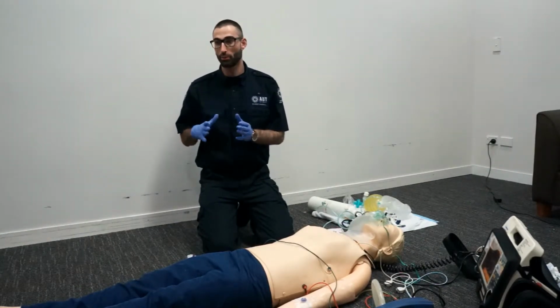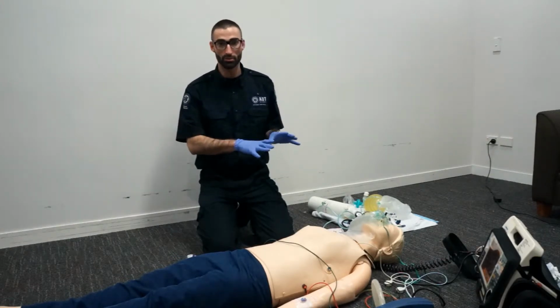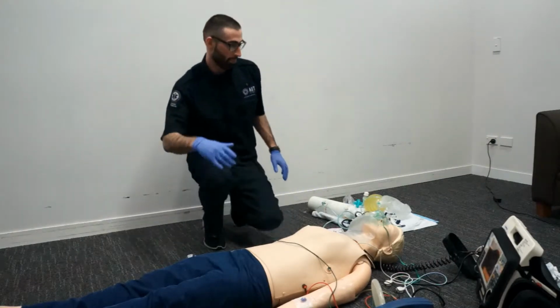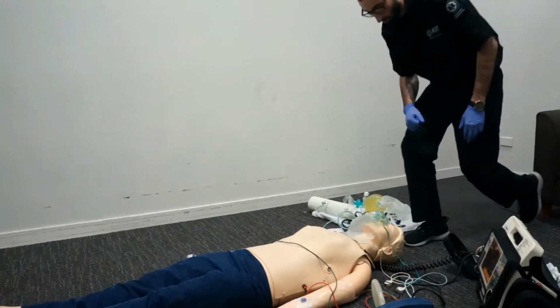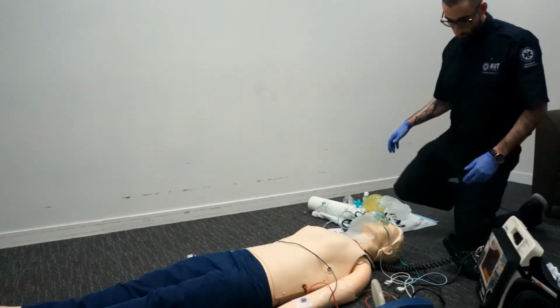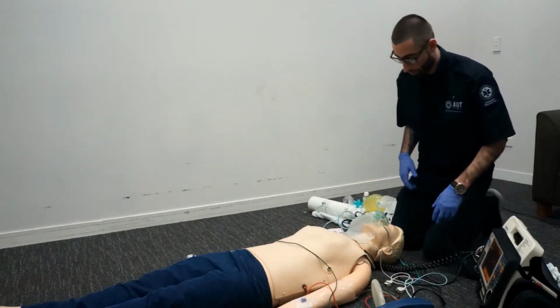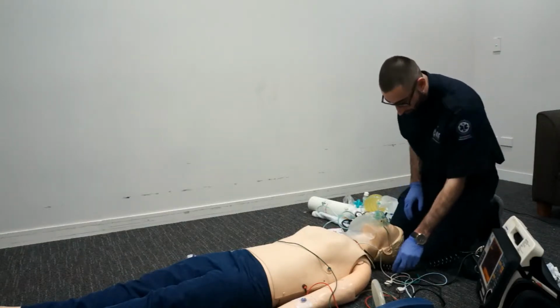I'll get my offsider to read this out to me, and I'll go ahead and check off the components of that and relay the information back to him. So I'm just going to go around to the head here, just so I'm not reaching over the patient, and I'm maintaining cultural sensitivity. Jake, can you go ahead with the first step, please? Place pads in either the apex sternum or anterior-posterior position, in addition to ECG electrodes.